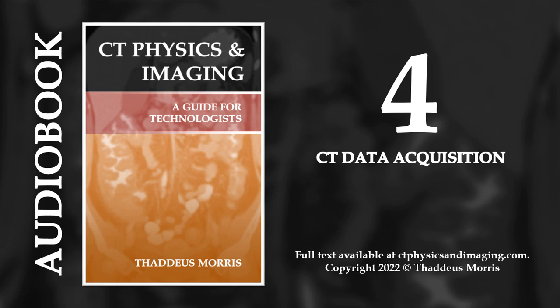Here's a case study. Clipping the lungs. After completing a CT of the chest, you notice that your DFOV does not include the entire lung field. Is there any way to retrieve the missing information, or should you just plan on offering your head to the radiologist? Here's the solution. There is a way, as long as the missing information is still within the scan field of view.